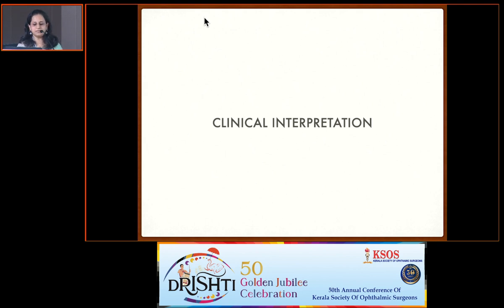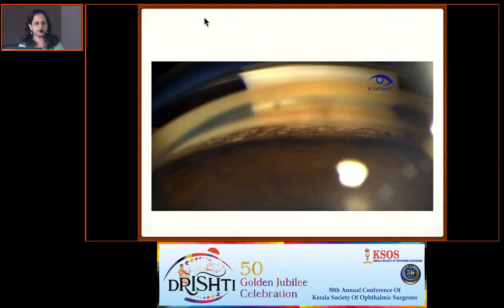Now I'll be showing some examples of some of the clinical interpretations. Some of the videos may be repeated, but still the more you see, the more you know. So you have pigments, this kind of pigments in angle is generally seen in pseudo-exfoliation syndrome.